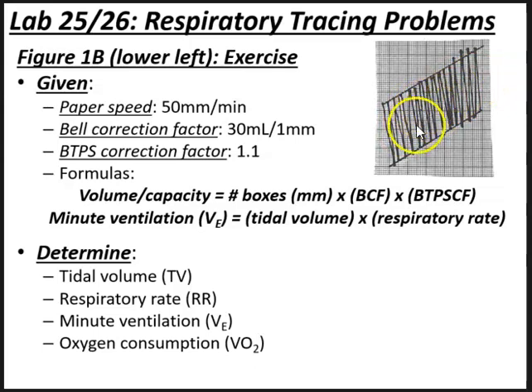And you guys can actually, well, now that you see the steps for rest, you can do the steps for the tracing for exercise.